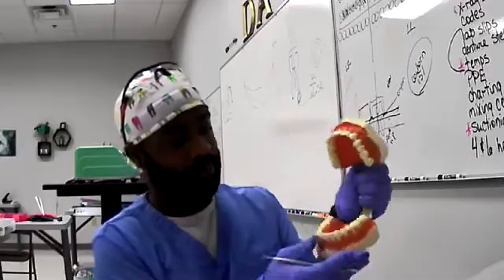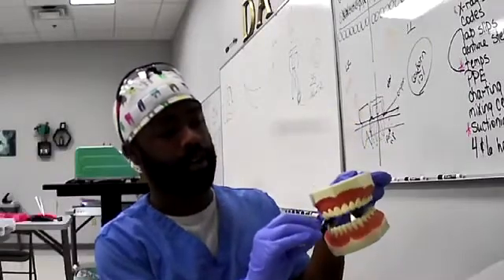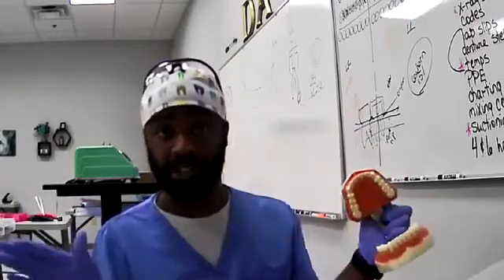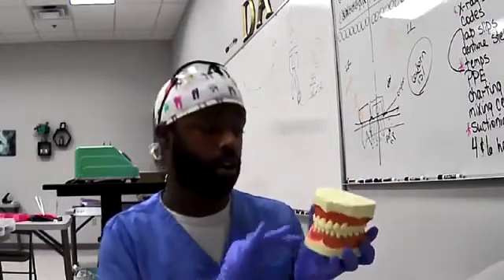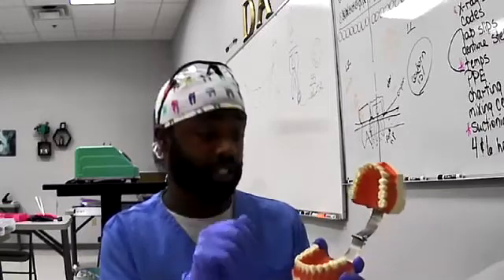Do a little tap, clean it off real good, and give them the bite again. Tap, tap, tap, grind, grind, grind. Check it out again. If you don't see any blue marks, it's good. If you do keep seeing blue marks, you're just going to have to keep adjusting it until there are no more blue spots. And you only want to adjust the blue spots.